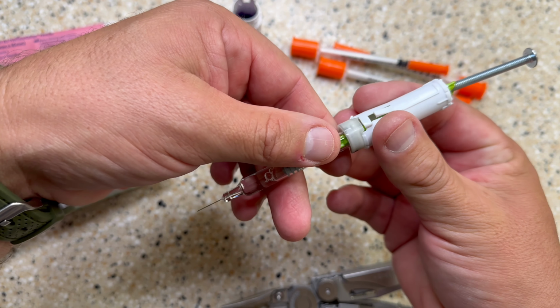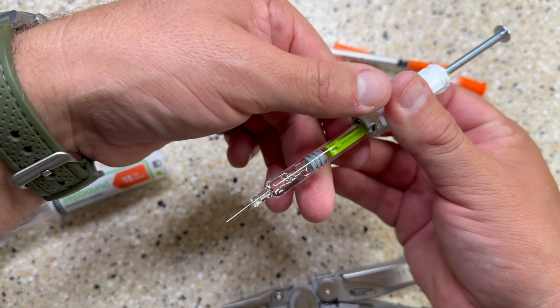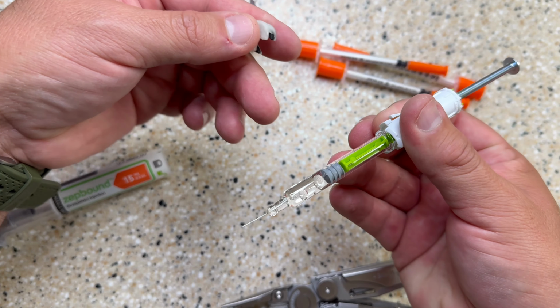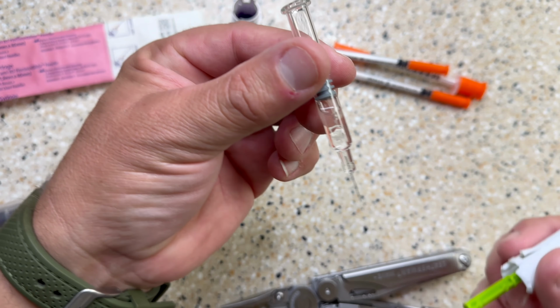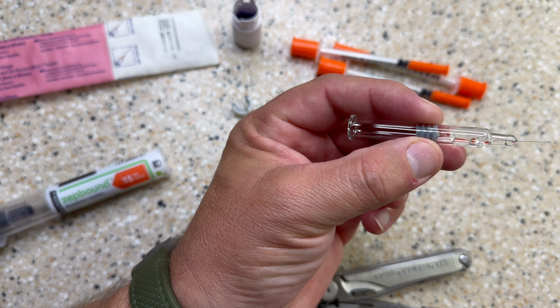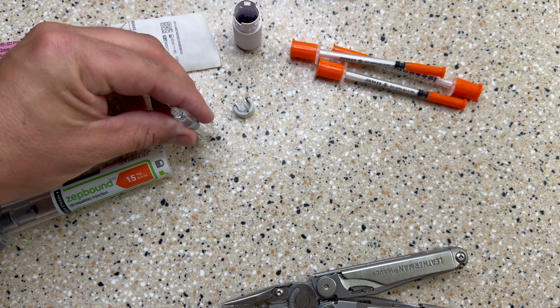First things first, we're going to pull back this little retainer, set that down, and your product comes out nice and neat. So we're going to set this here.